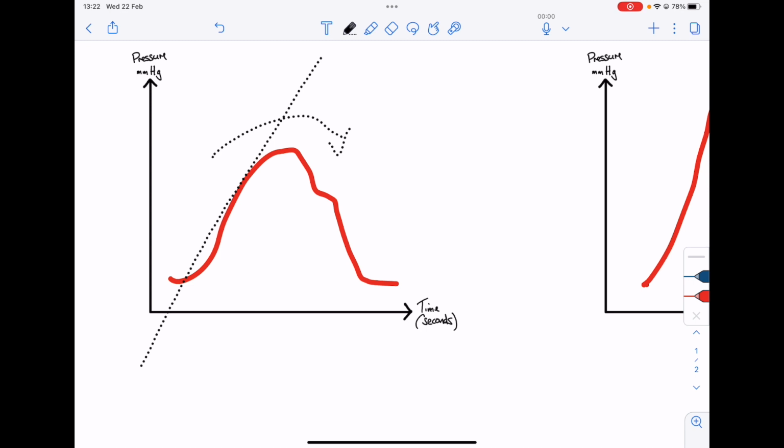If they're very acidotic, myocardial contractility is impaired. Metabolically, there's no glucose. If they're super cold, all these things impair the contractility of your myocardium and can lead to a sluggish-looking arterial waveform line. So this is aortic stenosis.